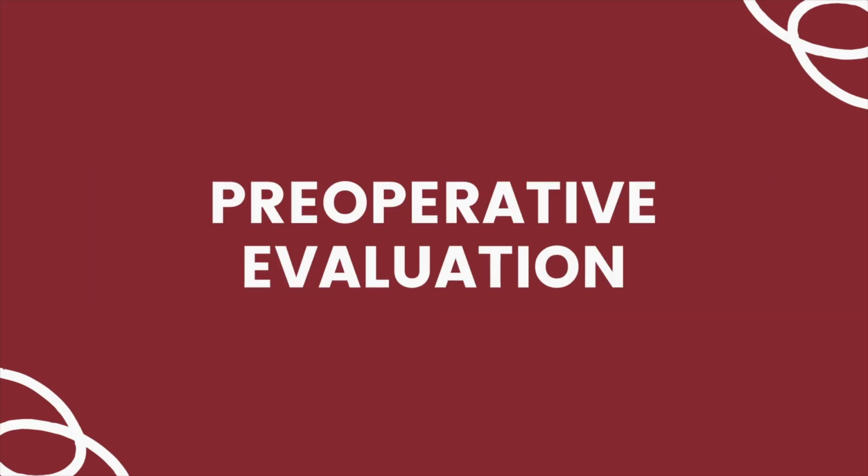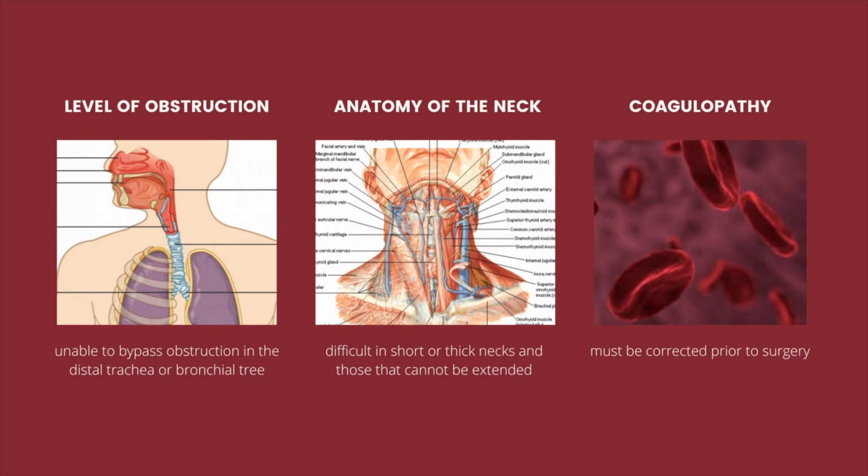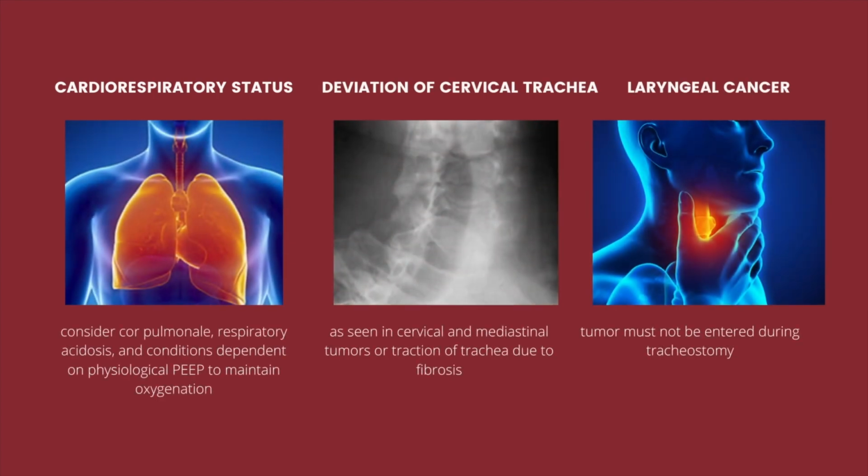Before performing tracheostomy, one must perform a thorough preoperative evaluation, and this includes the level of obstruction, the anatomy of the neck, the presence of coagulopathy, cardiorespiratory status, deviation of cervical trachea, and the presence of laryngeal cancer.